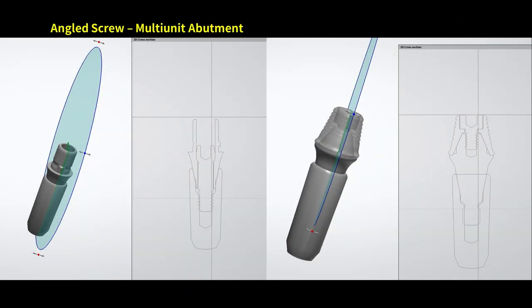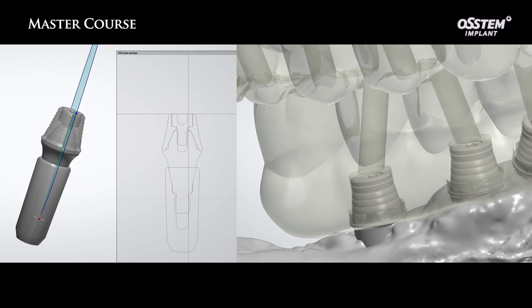Next, multi-unit abutment. On the left side, in the structure of the multi-unit abutment, the screw is on top of the cylinder, whereas with the link abutment the screw is a bit lower compared to the cylinder. So if you give an angle, the metal part is not hinged. If you have to twist the direction of the screw, sometimes it's better to use multi-units.